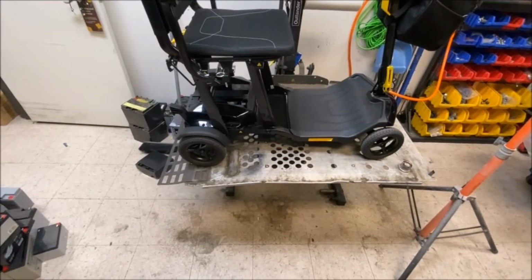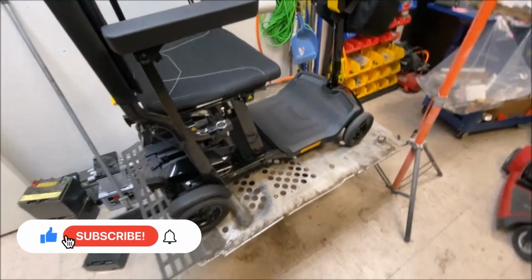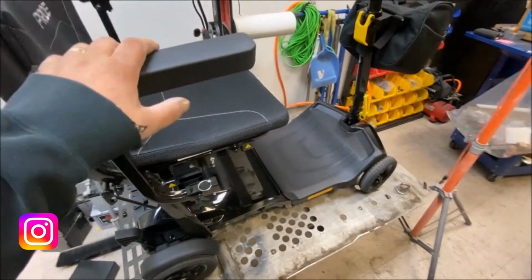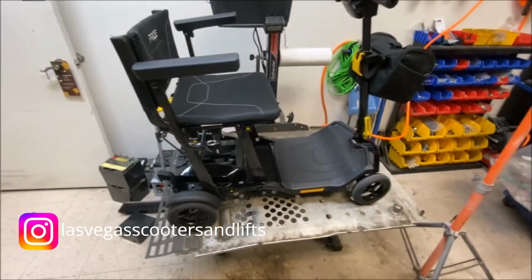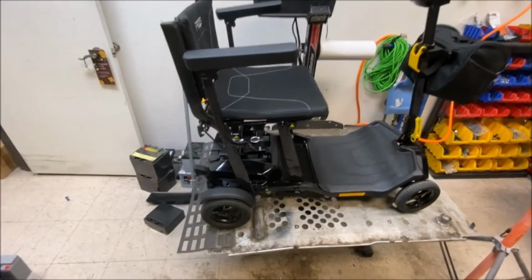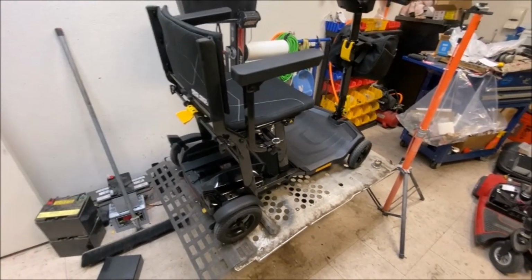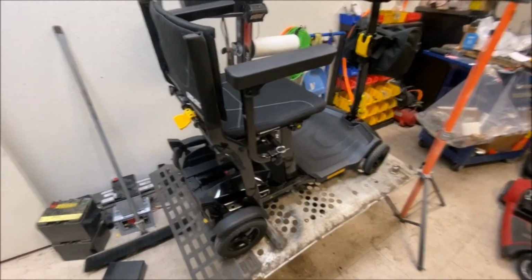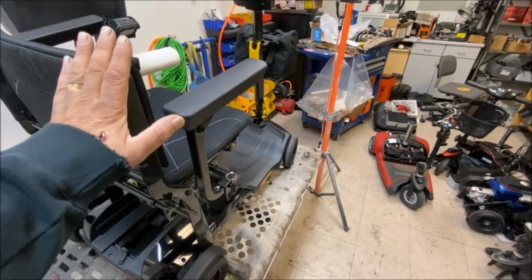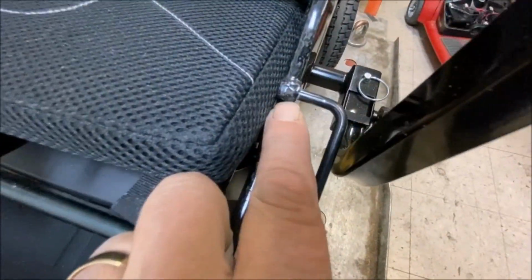Yeah, so we've got a super portable in for repair. Now, this is not a manufacturer failure, but maybe it is. Who knows? Maybe they can look into this in the future. But this is a customer scooter, and the customer resides in a care facility, and somebody was trying to help, but didn't know anything about the scooter, it being relatively new and different to most scooters, so they didn't really realize how to fold the seat. So what they did is put all the weight and pressure on this to fold it and broke it. And they broke the carbon fiber joint there.